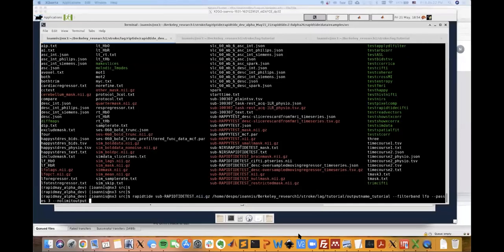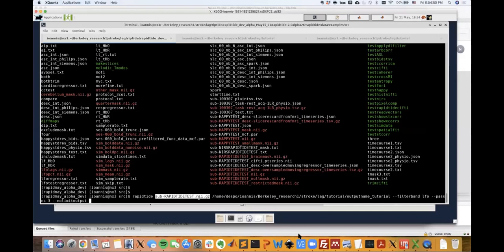Okay, so this is the basic bare bones command that we can use to run rapidtide. As I said, as it is now, rapidtide will use a global mean signal as an initial regressor for cross-correlating every voxel with it, and then it will output all the relevant measures based on that. So just to go over the arguments again really quickly, the first one is your input data. The second one is the path and prefix of your output data.